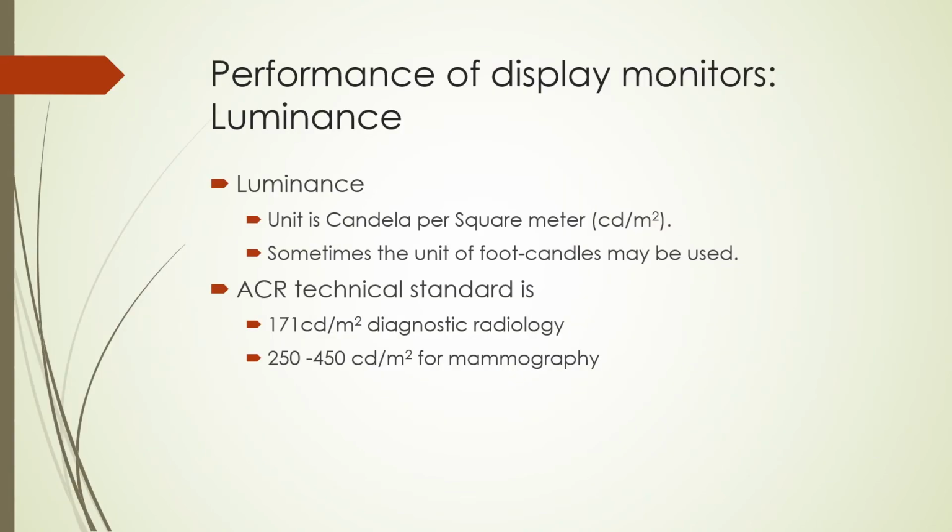Let's now look at the performance of display monitors. One performance metric of display monitors is specified as luminance. Luminance is the rate of light emitted or reflected from a surface per unit area per unit solid angle. The SI unit is candela per square meter. An older unit called the foot candle is sometimes used.